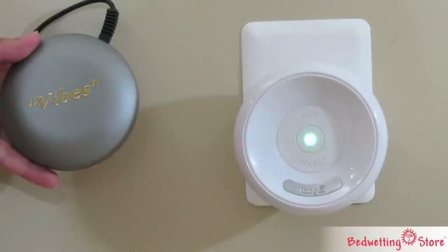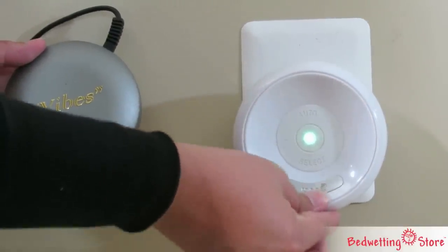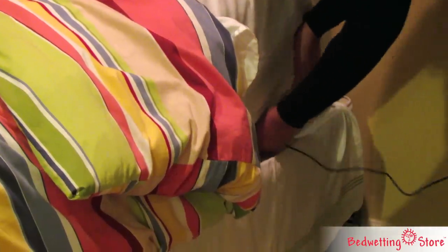For sound sleepers, a vibratory cushion can be purchased separately and attached to the alarm. It will trigger at the same time as the receiver sound and can be placed under a mattress up to nine feet from the receiver.